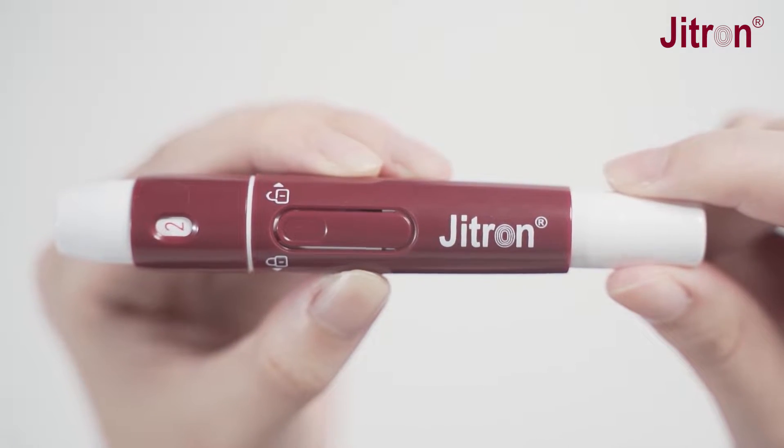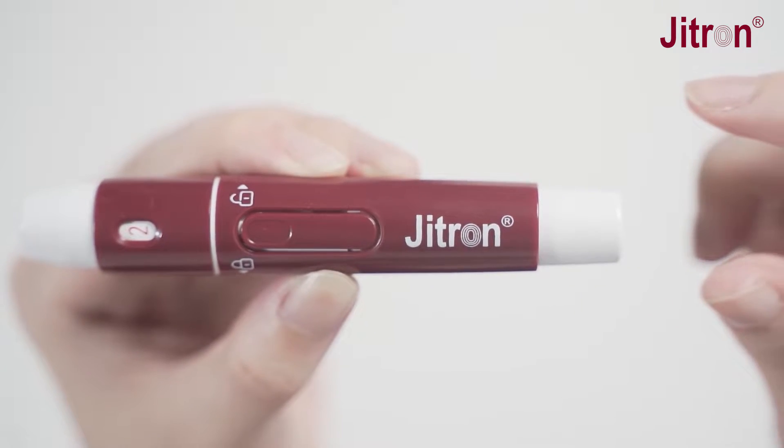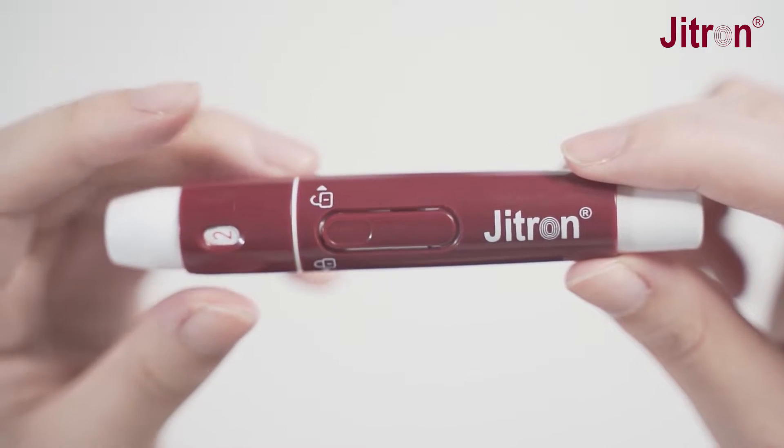Hold the hub in one hand and pull the plunger until it clicks, then release the plunger. The device is loaded and ready for puncture.